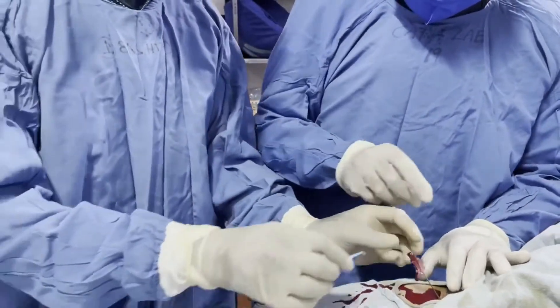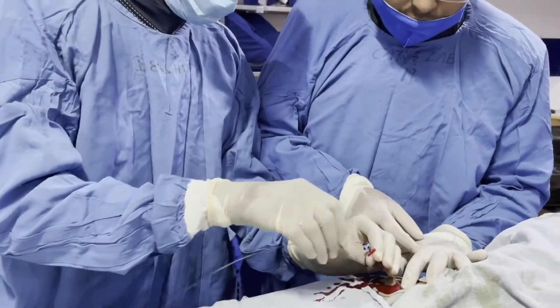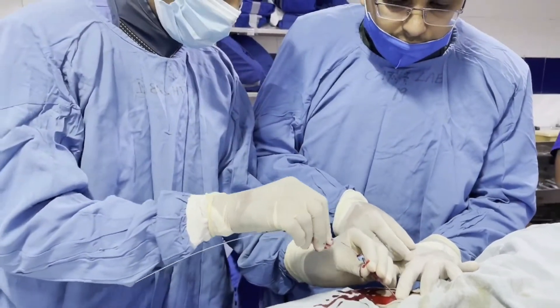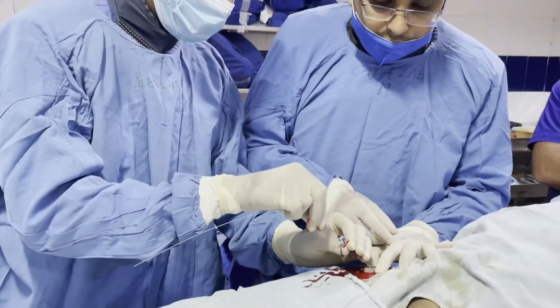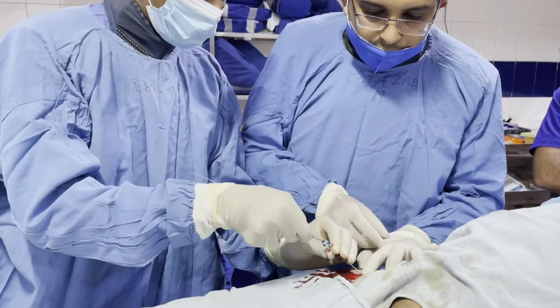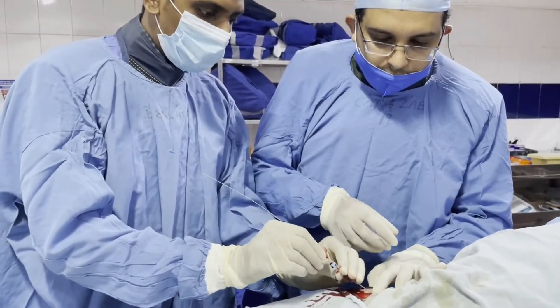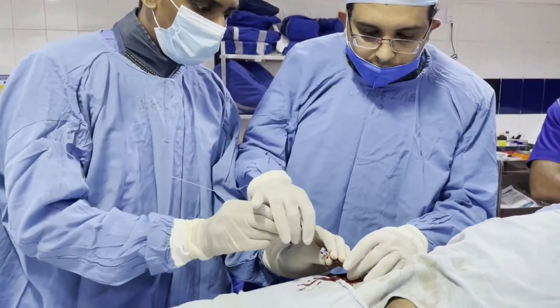Now you can see arterial blood gushing out. Once you get the gush of blood after the puncture, we insert the guide wire into the needle to make sure that we have obtained access properly.